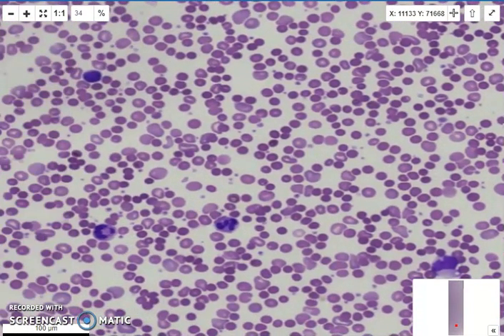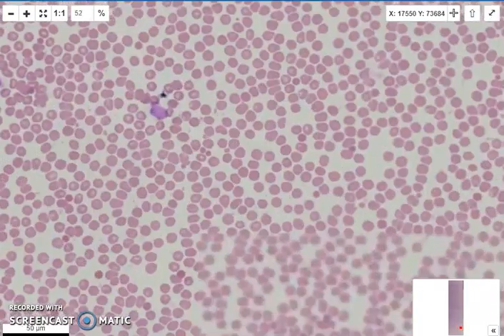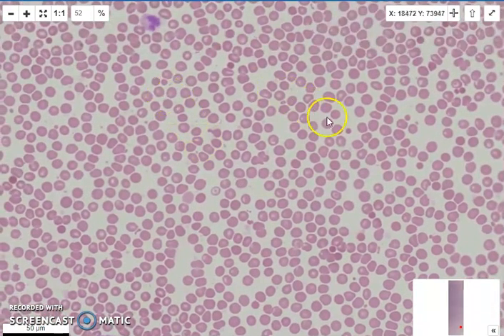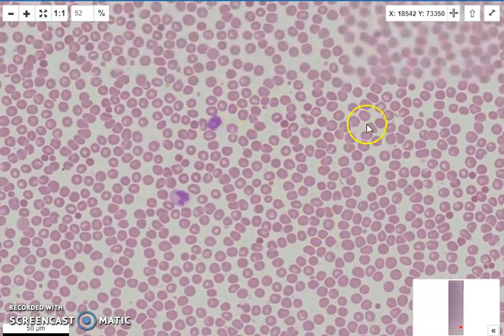There's something else I just wanted to show you. It's to compare that with the slide that is our Burns patient. So it's 5-6B. And in Burns, the spherocytes are referred to as microspherocytes. So they're like tiny little bits of the membrane that have budded off in the heat. You get these tiny, tiny little spherocytes, these microspherocytes. And so that is our feature with Burns.